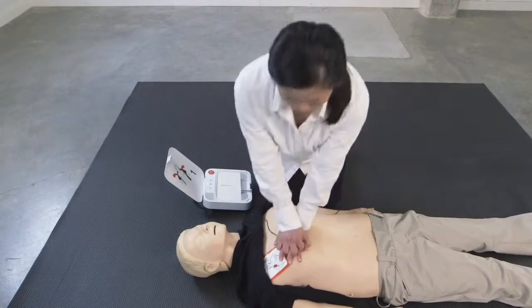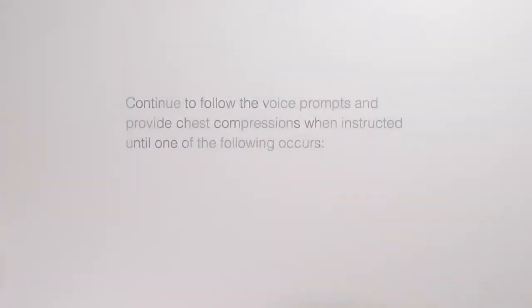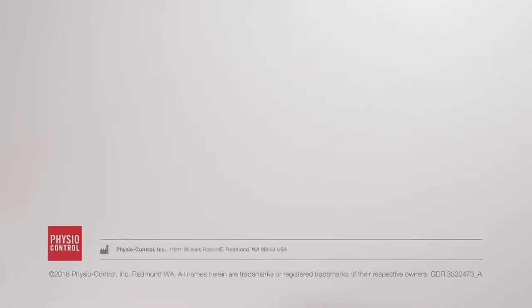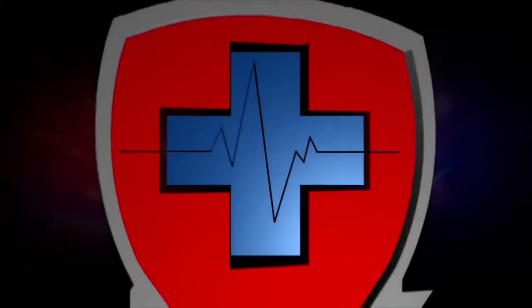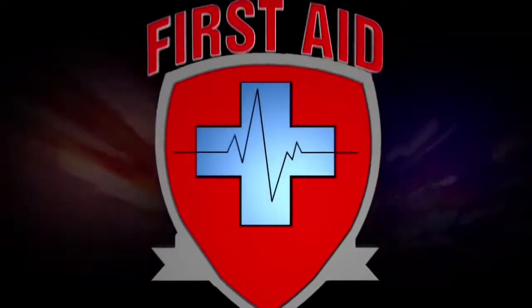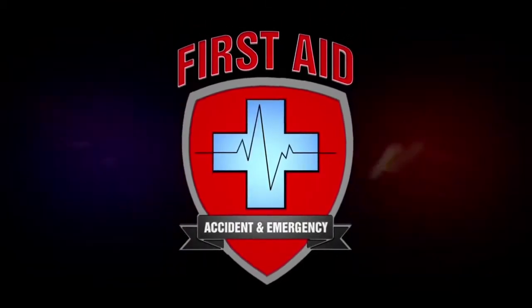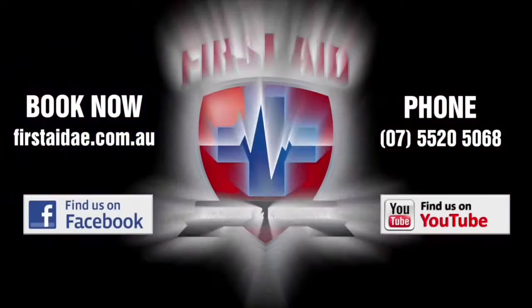Continue CPR on your patient and listen to the voice prompts until medical help arrives. Stop CPR if the patient starts to breathe or regain consciousness. If the patient vomits, clear the airway and then start CPR again until medical help arrives.